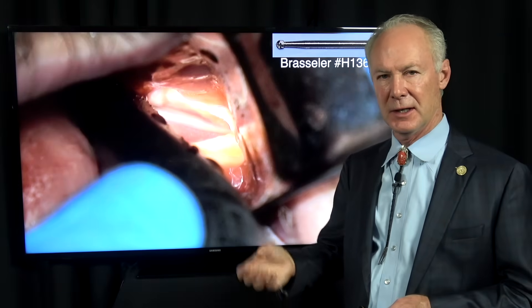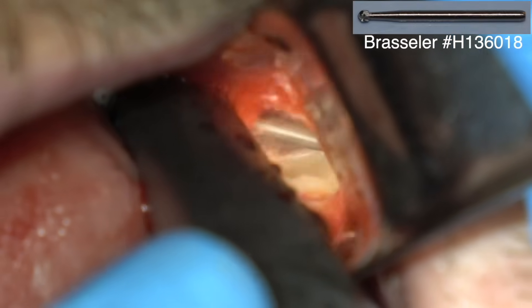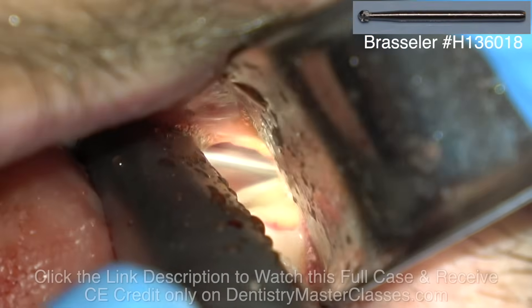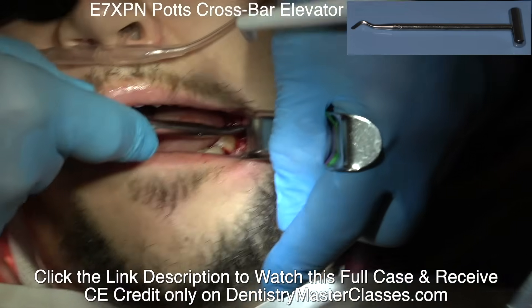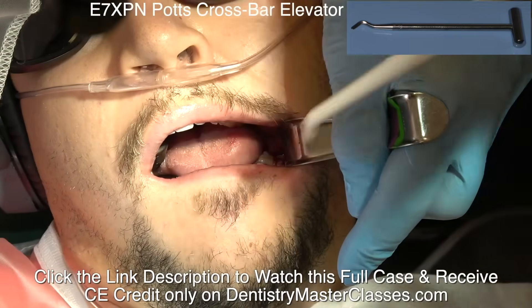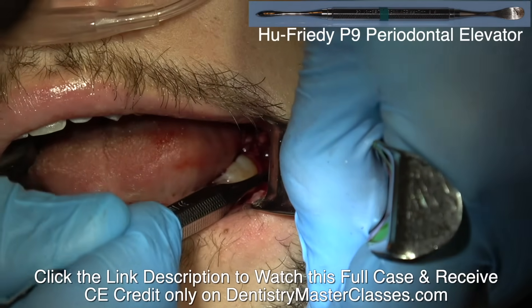That's why in surgery we've always said: if you have a root tip less than a third of the root and it's a mandibular wisdom tooth that's impacted, you may want to leave the root — do no harm. What's the worst thing that could happen? You sever or damage that nerve and the patient has a numb lip. They can live with a root tip that's up to a third of the root. So don't be a hero. If the root fractures, you don't have to remove all of it — you can leave up to a third. I've never seen that cause a problem with an impacted wisdom tooth. You don't want to do sloppy surgery and leave parts of the tooth if you can get it out, but in a case like this, if the root were to fracture, try to get it but don't take a chance on damaging the inferior alveolar nerve.